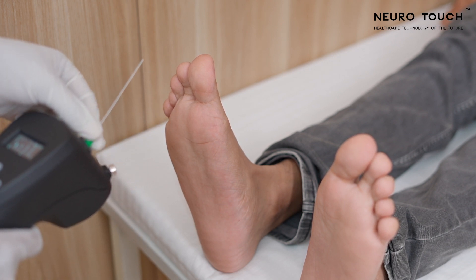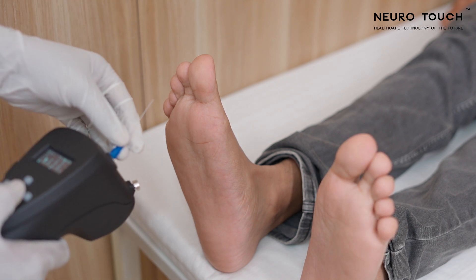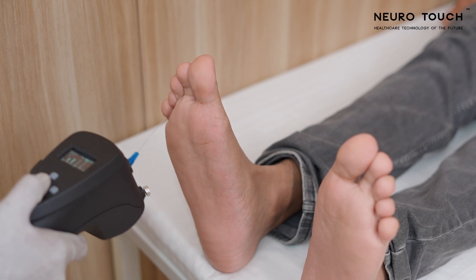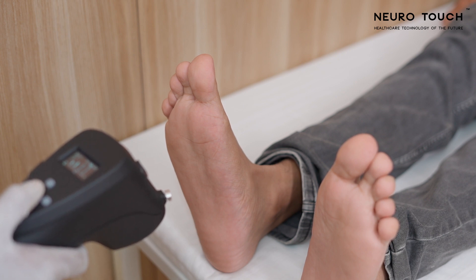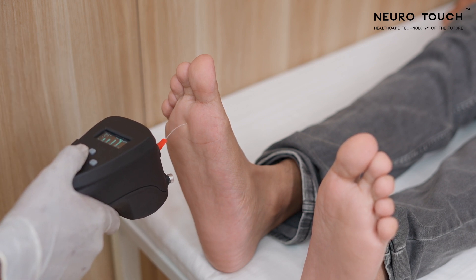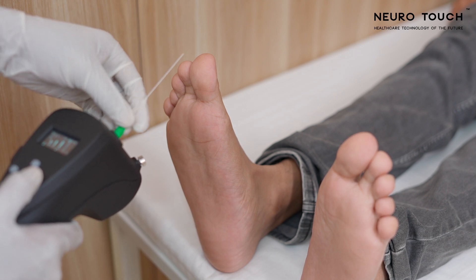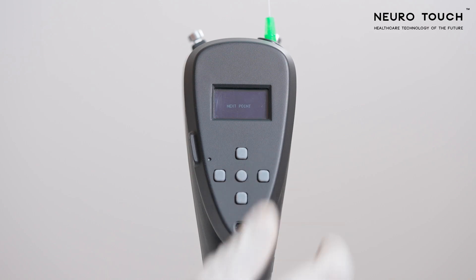The patient should perceive a touch sensation. If the patient can feel the touch sensation, press the center key followed by the right key to save the data. If the patient couldn't feel the touch sensation despite the green monofilament being completely buckled, use the blue monofilament and repeat the test. If the patient still fails to feel the touch sensation despite the blue monofilament being completely buckled, replace it with the red monofilament, reset the data, and repeat the test. If at any point the patient can feel the touch sensation, save the data by pressing the center and right keys.